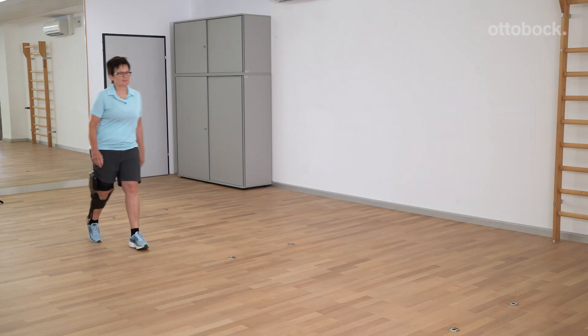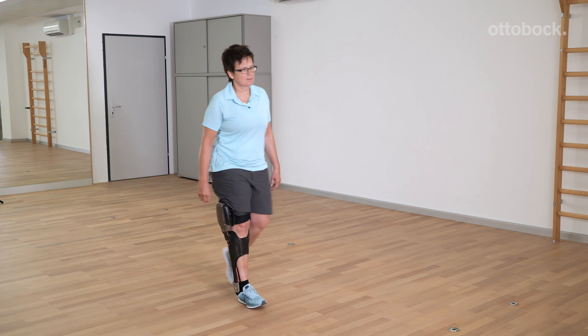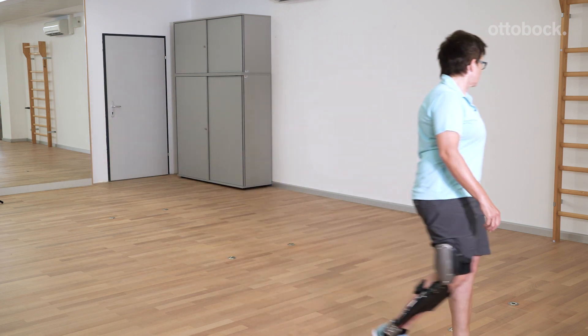The patient can practice walking without using walking aids, depending on their physical constitution.